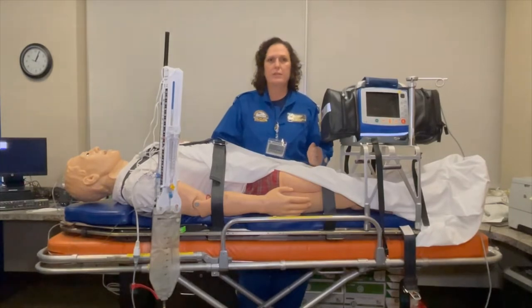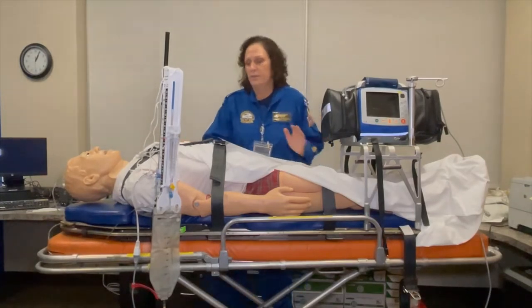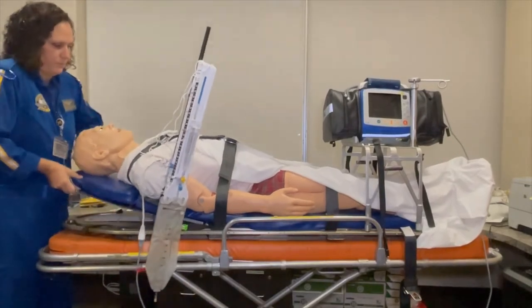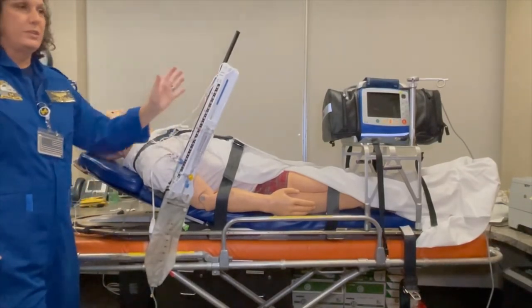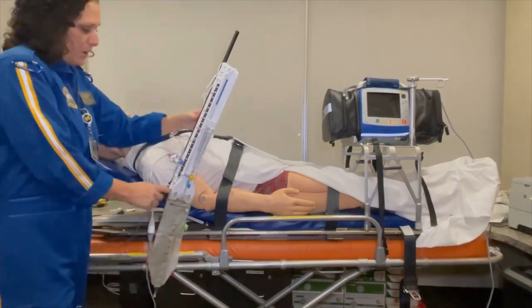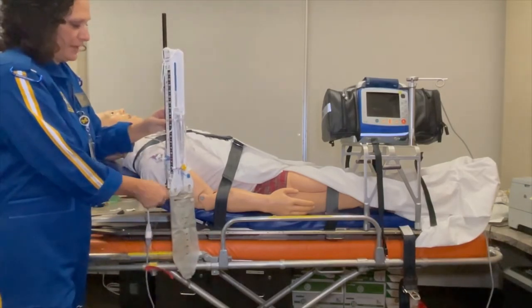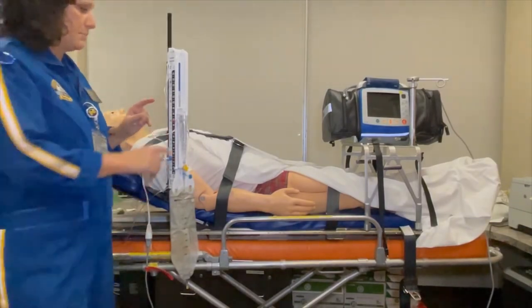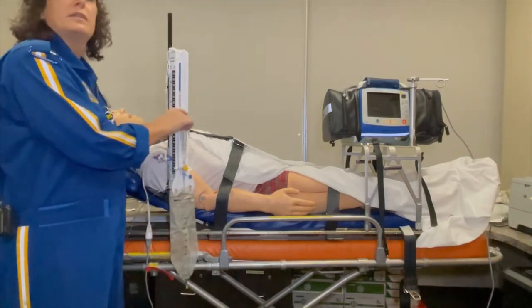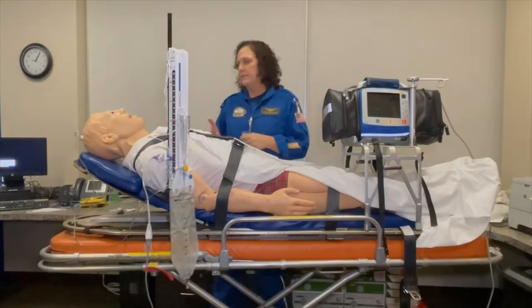Transport considerations to keep in mind when transporting patients with a Ventrix. First, elevating the head of the bed — head elevation is one way to mitigate elevated ICPs. Notice what happens to our buretrol when we elevate the head of the bed. This only applies to the new system; the old Monitor system does not have this capability. But on the new system, there's a screw down here — like an antenna — and you can loosen that screw and straighten the system back up to keep your buretrol straight while elevating the patient's head. This is beneficial because if it's off to the side, CSF dripping can get the membrane wet, preventing you from zeroing the system.